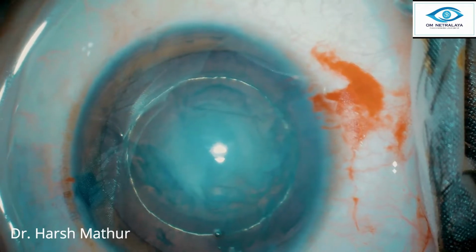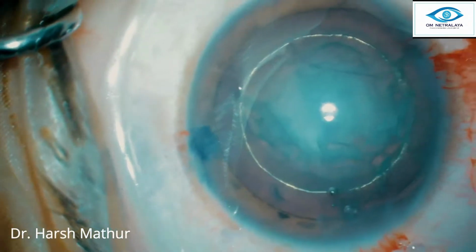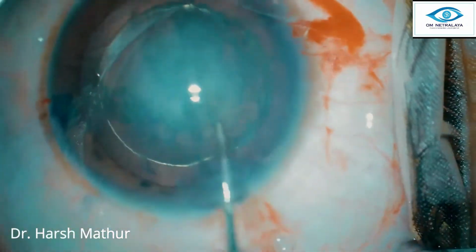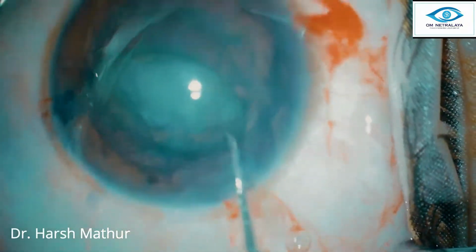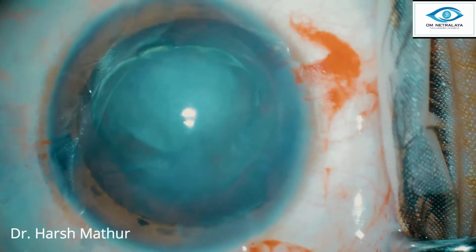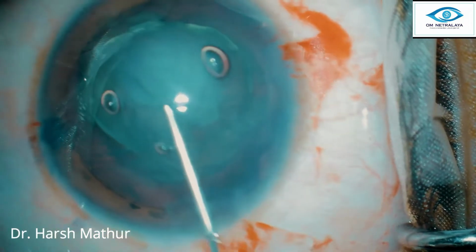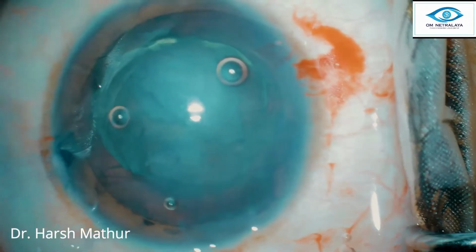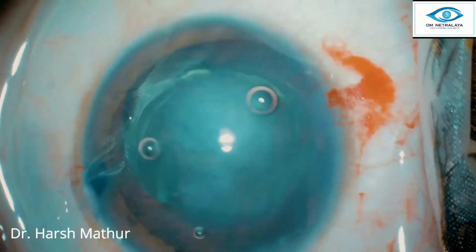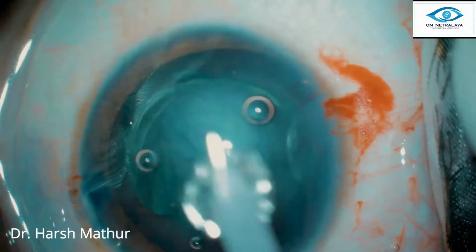So the next method was to do a hydrodelineation, and once it's done, now I'm trying to rotate and bring out this endonucleus up, and I'm able to do that. So this small endonucleus easily comes out through this 5.5 mm of rhexis, and now it can be easily managed without using much of phaco energy.